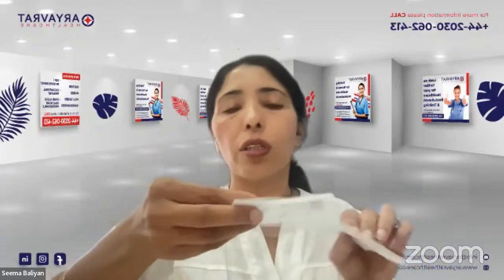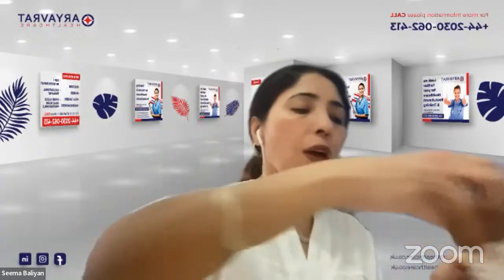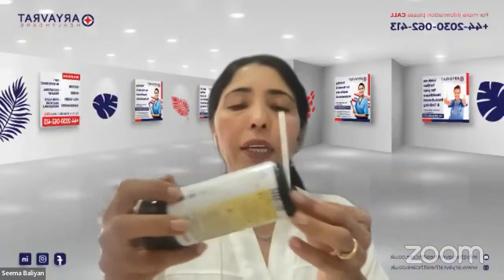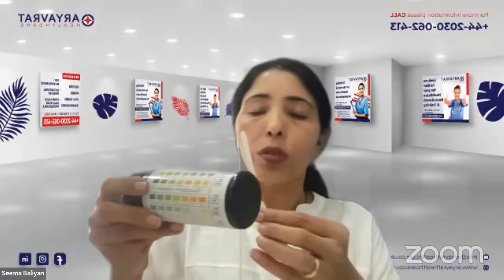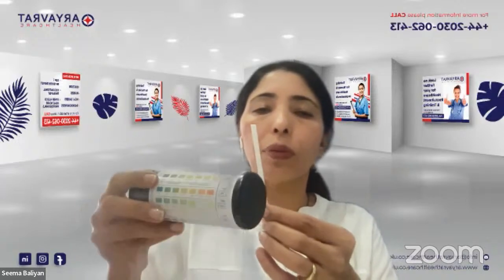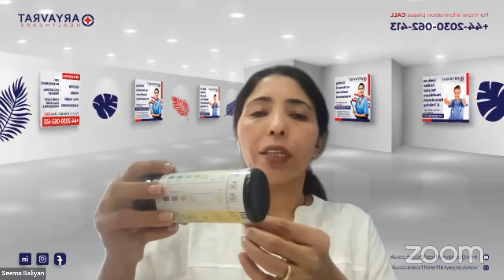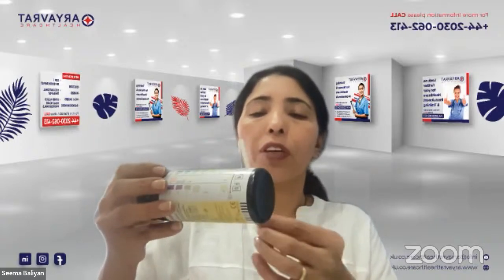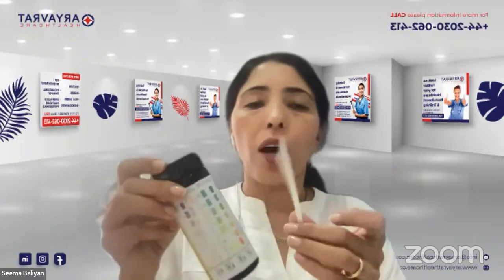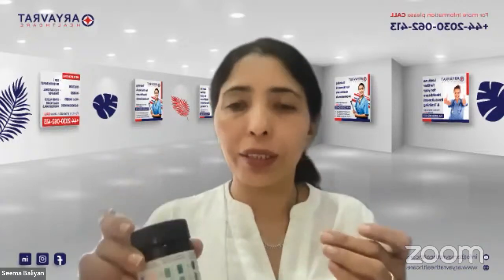So once your 30 seconds are over, then you are going to be telling the examiner that now I'm going to start reading at 30 seconds. So at 30 seconds, I'm going to be reading the glucose. So you are going to be measuring with the strip, checking your glucose. At 40 seconds, you will check the ketones. And at 45 seconds, you are going to be checking the specific gravity.